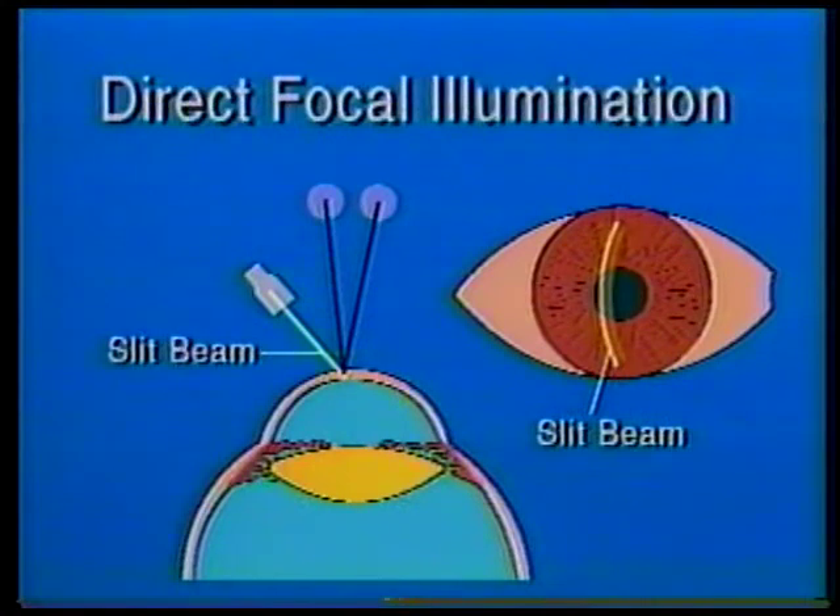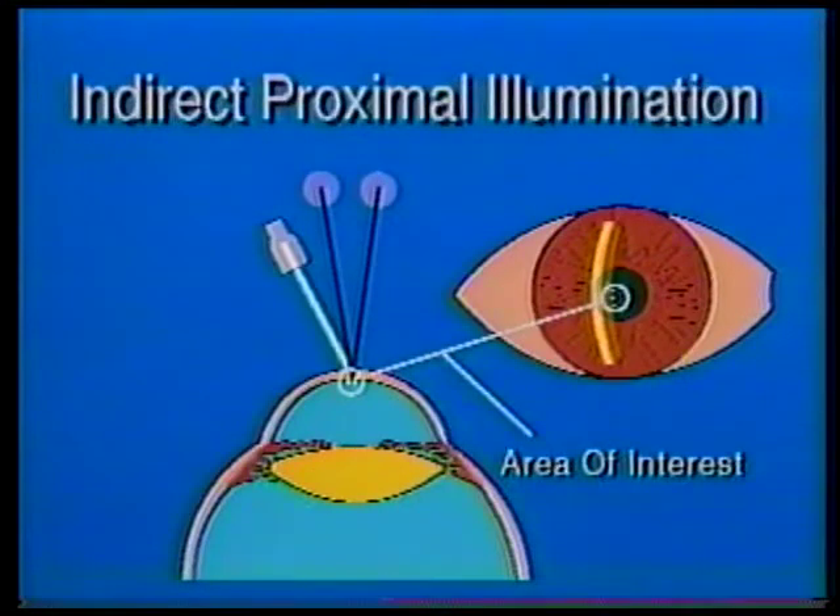Two, direct or focal illumination. This makes use of the hairline slit beam. The microscope and slit beam are directly in focus on the object being examined. This is particularly suited to depth localization and shows that this corneal abrasion is very superficial. Three, indirect proximal illumination. This maneuver highlights the object being evaluated at the side of the light beam, not directly where the light is focused, such as these KP or keratitic precipitates.